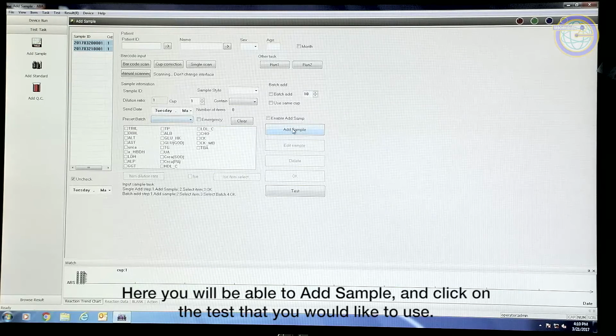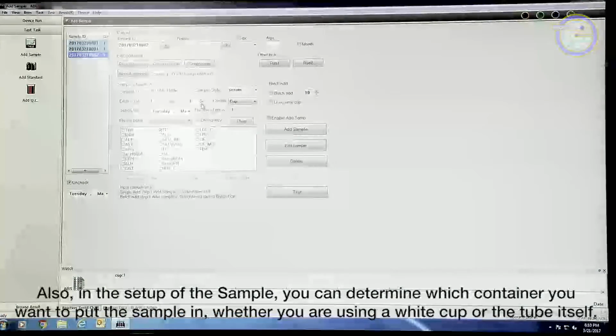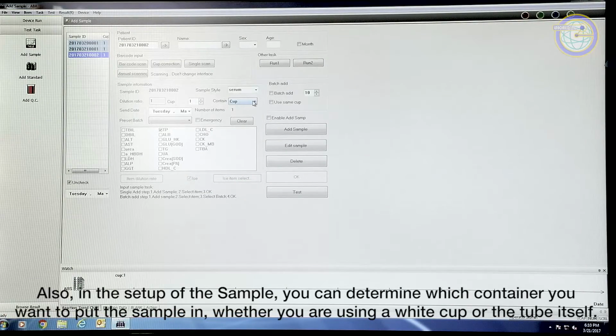Here, you will be able to add sample and click on the tests that you would like to use. You will see that the patient ID is populated, and you can add name and other identifying factors if you would like. Also, in setup of the sample, you can determine which container you put the sample in, whether you're using a white cup or the tube itself.